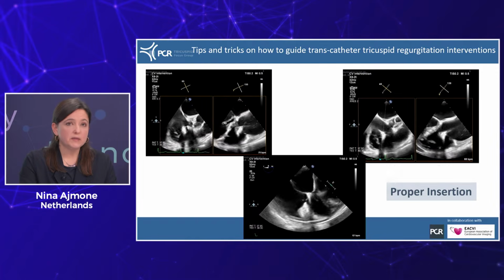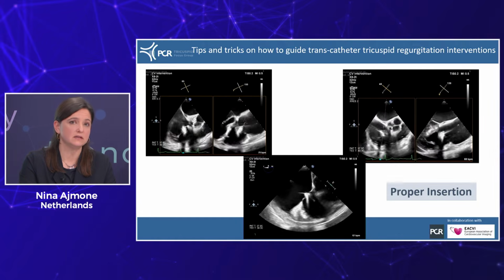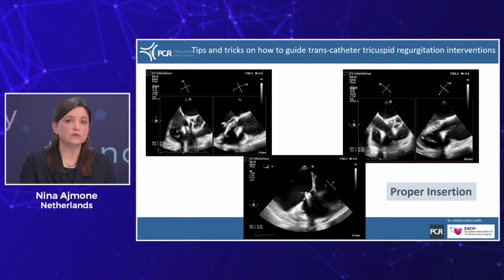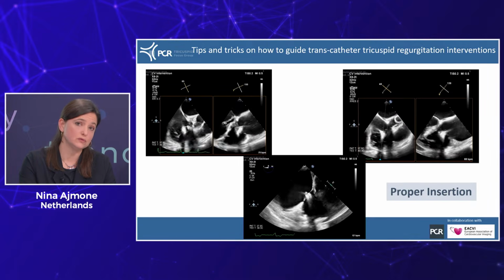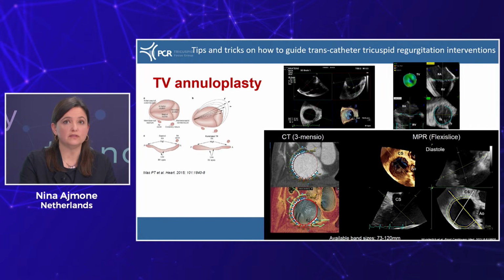And a very important moment also to guarantee the results of the procedure is to guarantee a good proper insertion of the leaflet. And this is the moment where we spend much more time to really check that the leaflet is well included in the clip, and how much of the leaflet, using all these different views, often going deep transesophageal to see very well the grasping and the insertion of the leaflet. And finally, as I said, some specific point of attention only for the annuloplasty here.